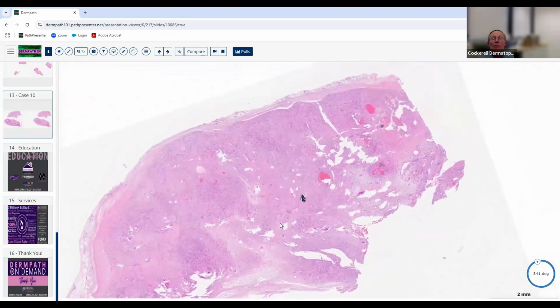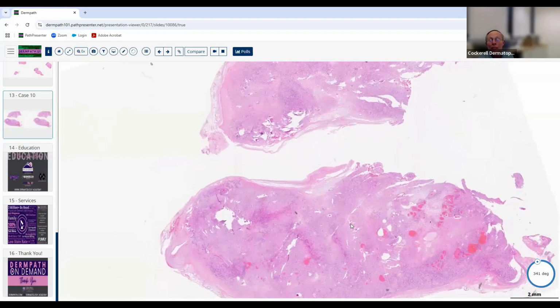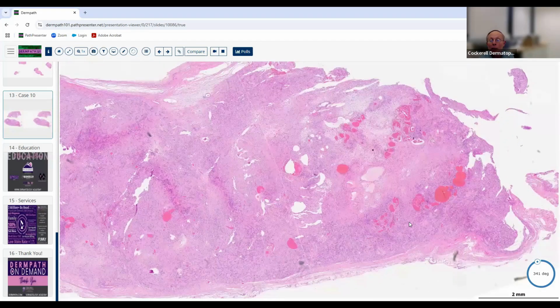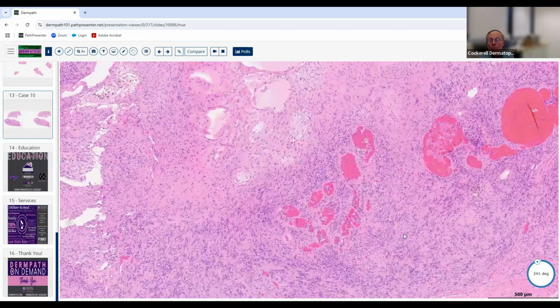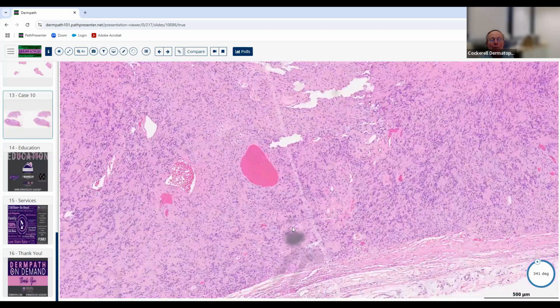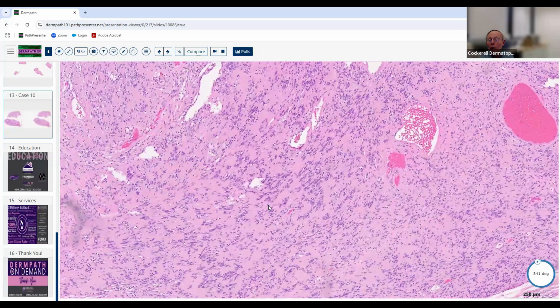But basically the way these lesions develop is they come off the outer part of the nerve twig and form a little nodule or bump off of the pre-existing nerve twig, whereas a neurofibroma comes from within the nerve twig and sort of explodes out. So this is a neurilemmoma, schwannoma. This is making Schwann cells as opposed to the granular cell tumor, which didn't really make any myelin. Here you've got Schwann, myelin, and you've got the Verocay body. So this is an Antoni A type of neurilemmoma or schwannoma.